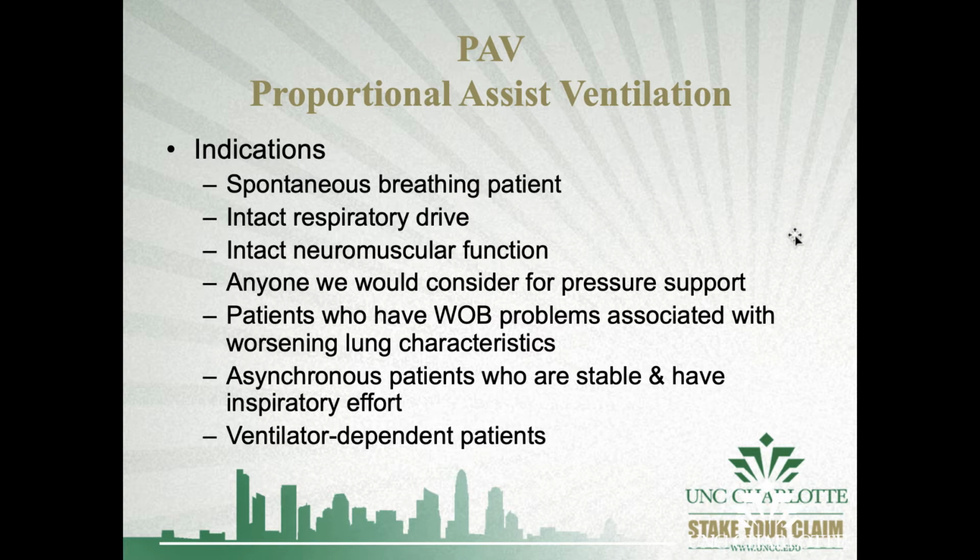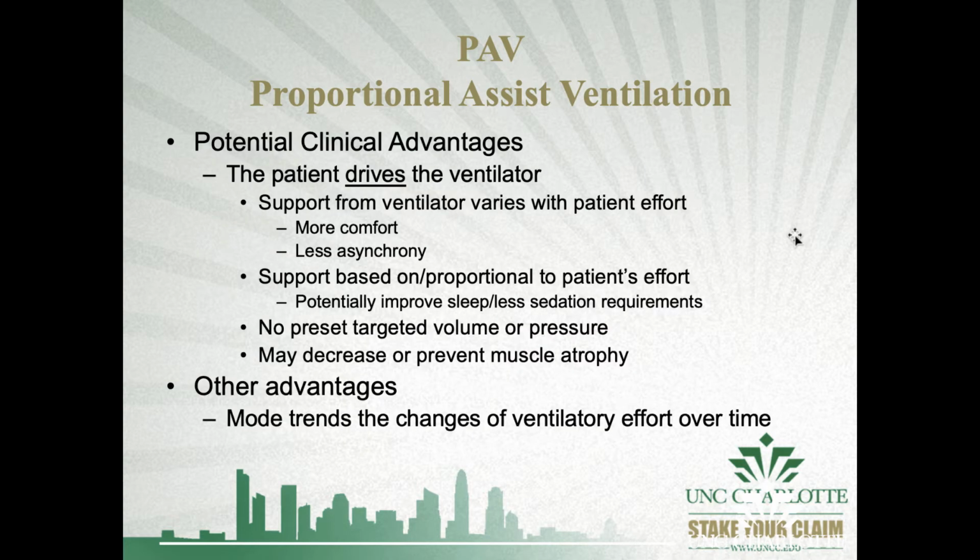So basically our spontaneous breathing patients, some of our COPDers, I really would be reluctant to do that, but there's some evidence that shows that PAV actually increases the patient's comfort on the ventilator in patients with COPD and exacerbations as such. But just like PRVC in these kind of modes, the bigger breaths these patients take, or their tachypnic or whatever it may be, the algorithm that's associated with these programs gets kind of all wacky, and it doesn't really support the patient well, and actually can cause more dysynchrony and more discomfort. And that's my experience that I've had with the handful of times I've used PAV, but like I said, it can come down to user error as well.